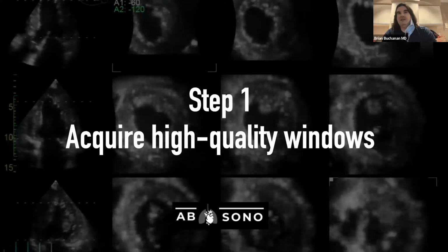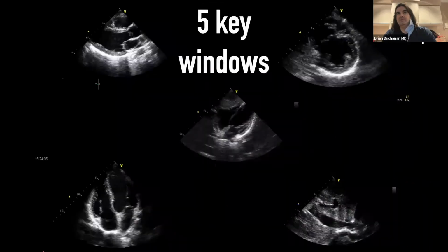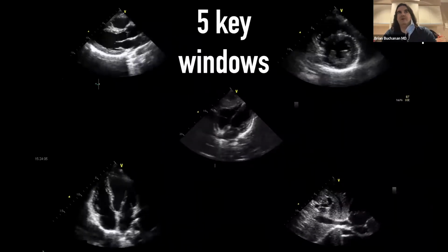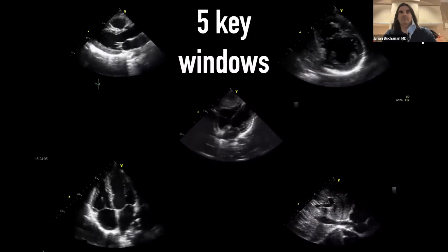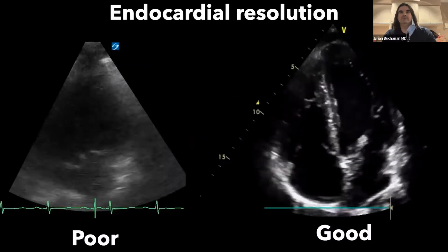So the first thing is, to actually assess the LV, you need high quality windows. If we look at five key windows: top left, parasternal long axis; top right, parasternal short; in the middle, subcostal four-chamber; bottom left, apical four-chamber; and bottom right, IVC is just a good thing to have as part of your exam.